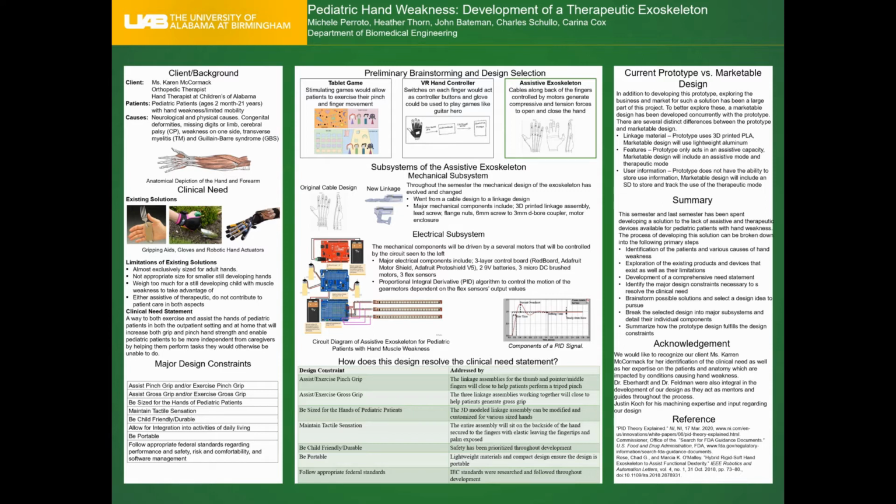development. With the assistive exoskeleton design selected for further development, its overall design was divided into 2 subsystems, the mechanical subsystem and the electrical subsystem. The mechanical design is currently the 3rd revision after analyzing the limitations after each iteration.